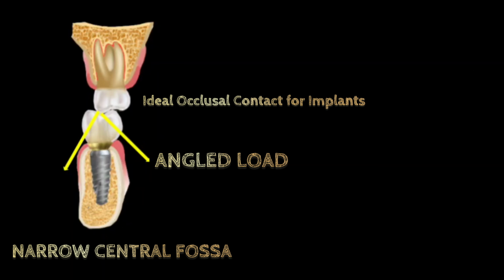Upon occlusion with opposing anatomical cusp, it may be necessary to recontour the opposing natural cusp to occlude in the central fossa over the implant body. If the implant crown mimics the natural cusp angle, premature contact will occur on the cuspal incline, and the resulting direction of load may be 30 degrees to the implant body. Selective recontouring of the opposing dentition ensures axial loading.